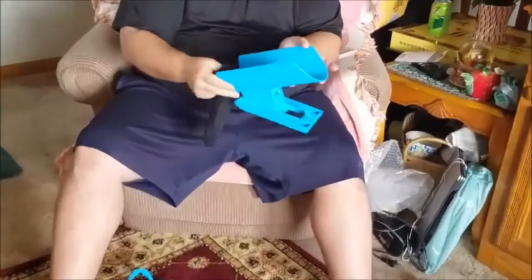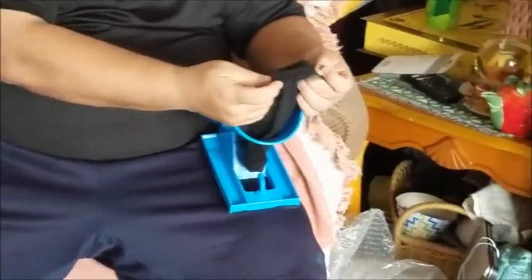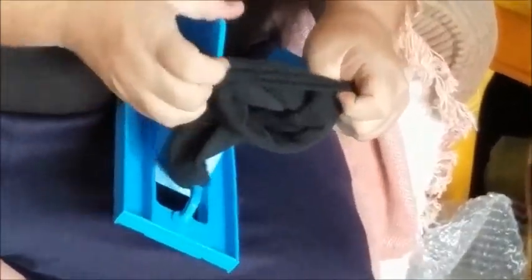What you want to do — this is going to be the top, this is sort of like your ankle. You want to make it to where the inside of the sock is exposed. You want to put it up over like this, to where the inside is what's being exposed.